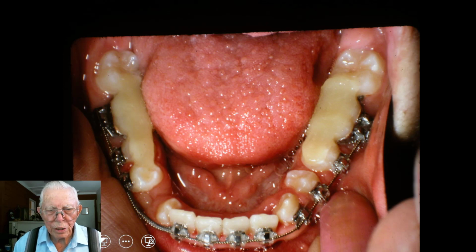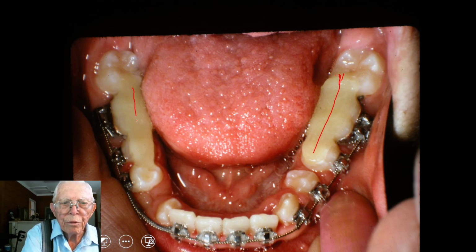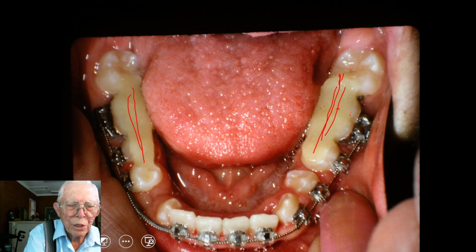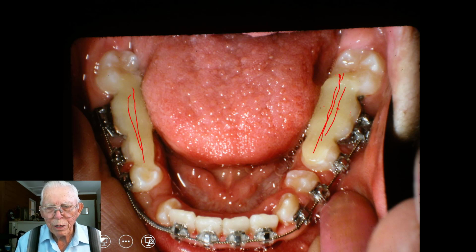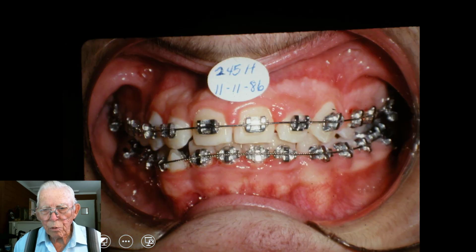This is just showing you these little thin acrylic blocks, and when you get ready to take it off, you take a kind of a barrel burr and make a groove right down through the middle of this. And you'll have a gap in here. Then you squeeze one side against the other. This is just acrylic. Now don't put any composite or stuff like that on it, and you can pop these off quite easily, but they rarely ever come off when you're doing this. Now let's go on from there.